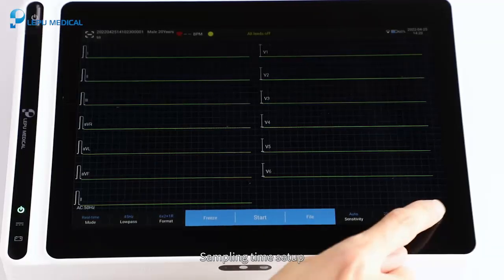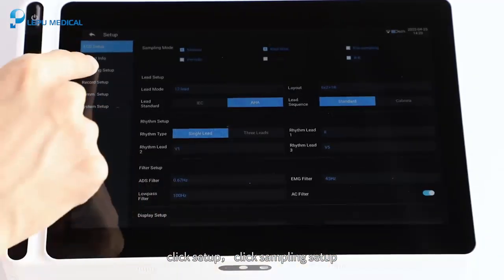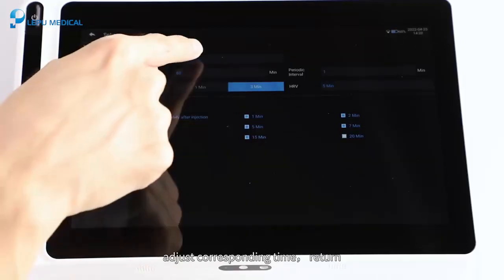For sampling time setup, click Setup, then click Sampling Setup, and adjust the corresponding time.